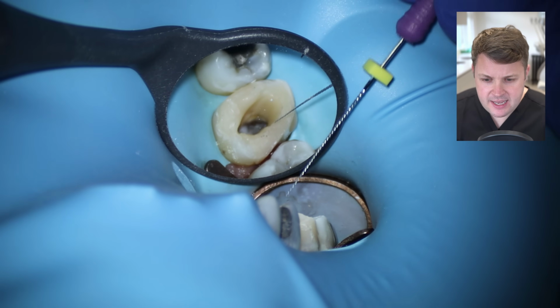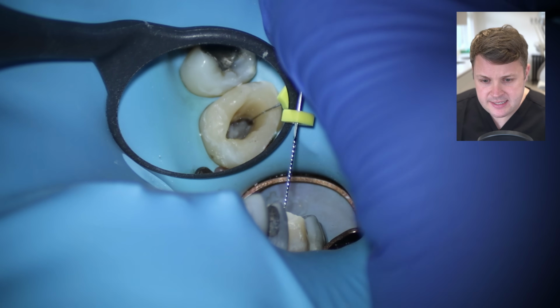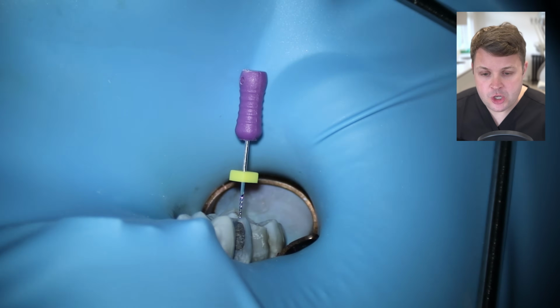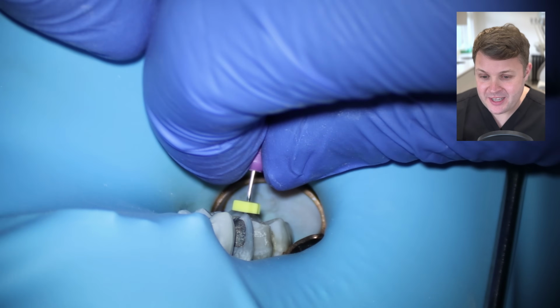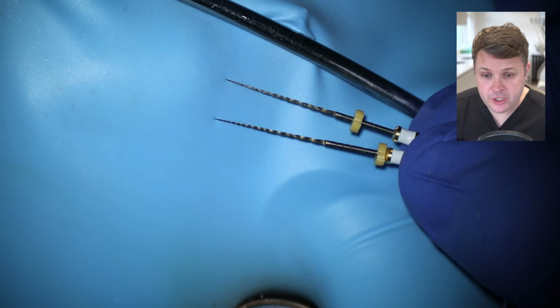And in this case, I don't want to go straight for my glide path file at 0. So I'm going to use a size 10 K file just to open up the MB2. I've come really, really far with this. The worst thing I want to do here is block or ledge this canal. So we're going to use a size 10. And I feel like the previous glide path file has done a lot of work, and so I'm going to replace it with a brand new one.